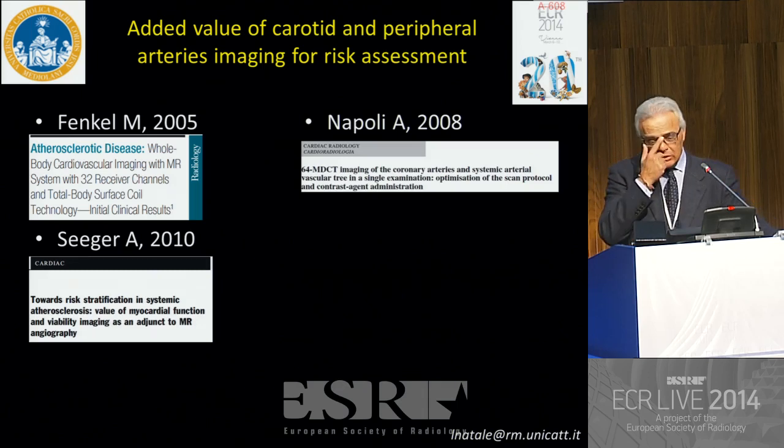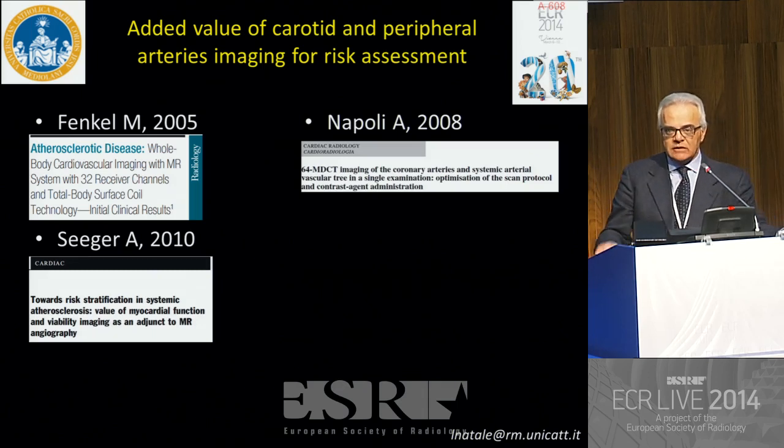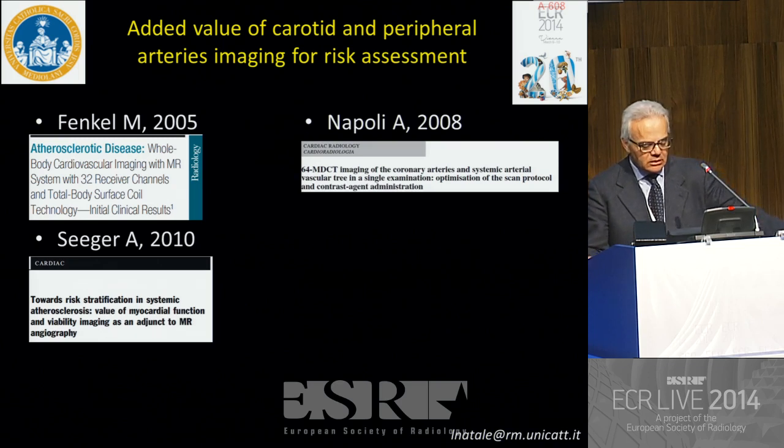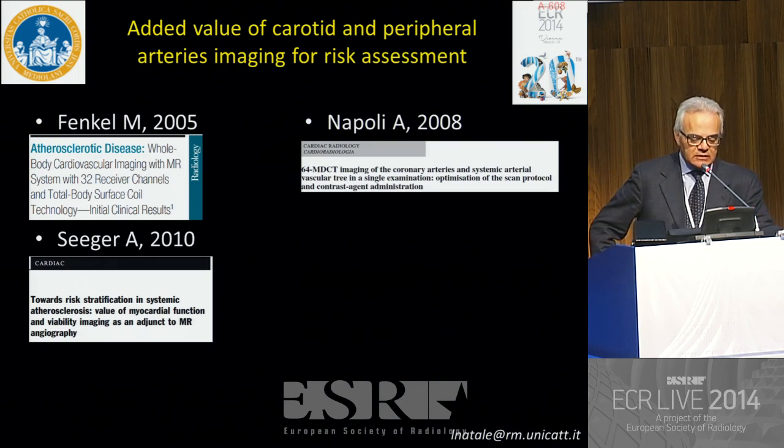But the problem is not only the stenosis, as we know since many years. The paradigm has shifted from the stenosis, from lumen assessment, to the wall, as I will try to demonstrate in the next minutes.